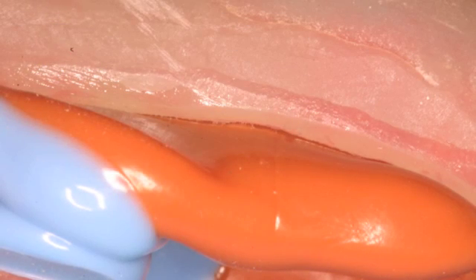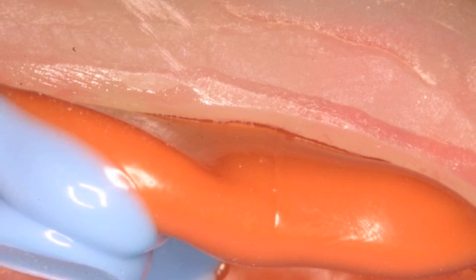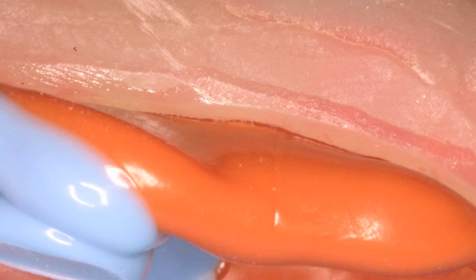This photo is an example of the impression material pulling away from the tray when it is removed from the model. It is inaccurate and the impression should be retaken.